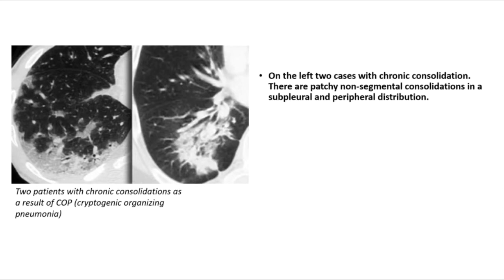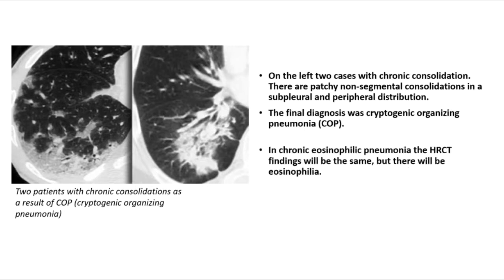Two cases with chronic consolidation show patchy non-segmental consolidations in a subpleural and peripheral distribution. The final diagnosis was cryptogenic organizing pneumonia (COP). In chronic eosinophilic pneumonia, the HRCT findings will be similar but there will be eosinophilia. Bronchoalveolar carcinoma can also have a similar appearance.